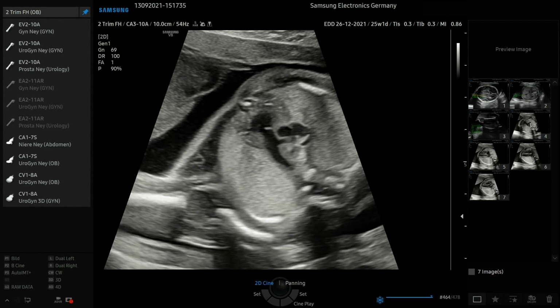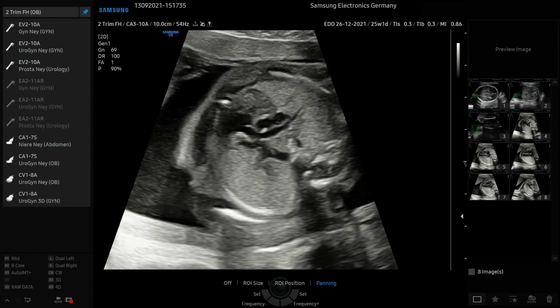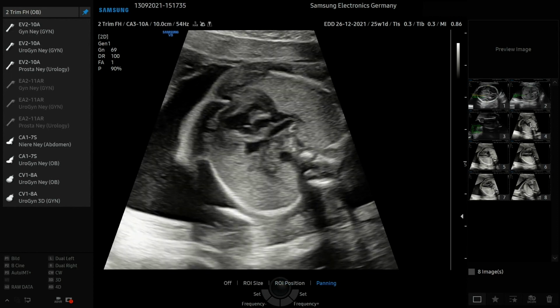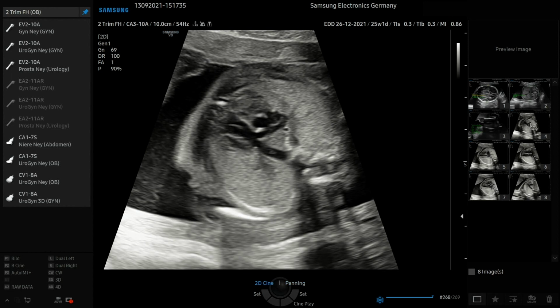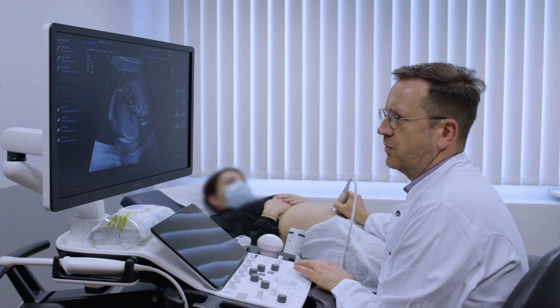You see the branching of the right pulmonary artery, and on this side the arterial duct going to join the transverse aortic arch. This is what you need to judge the cardiac integrity seen in the normal B mode.